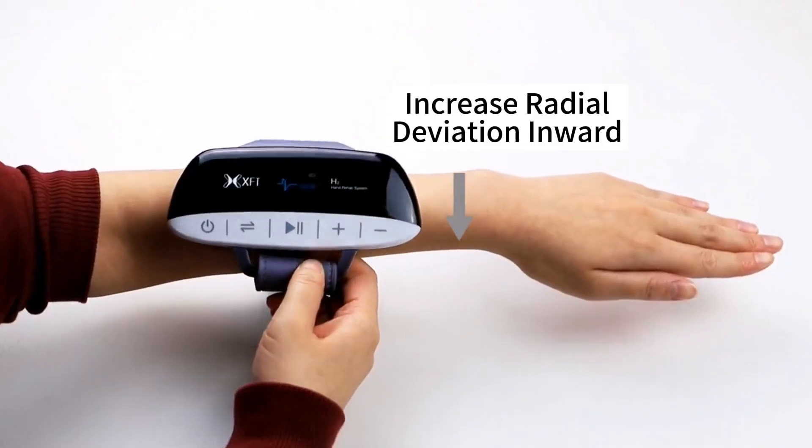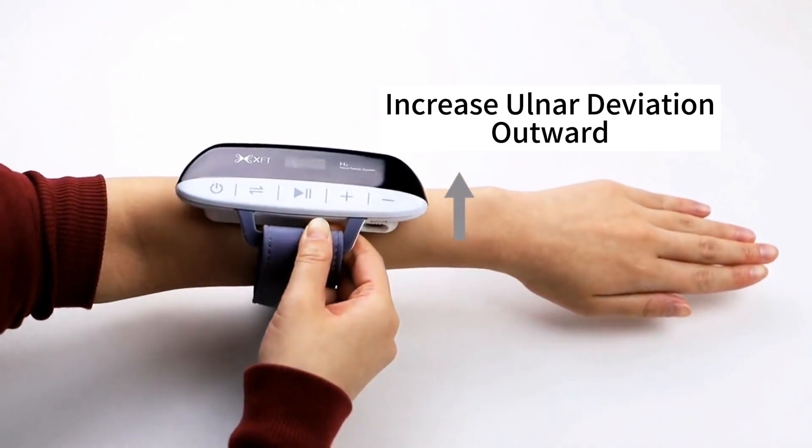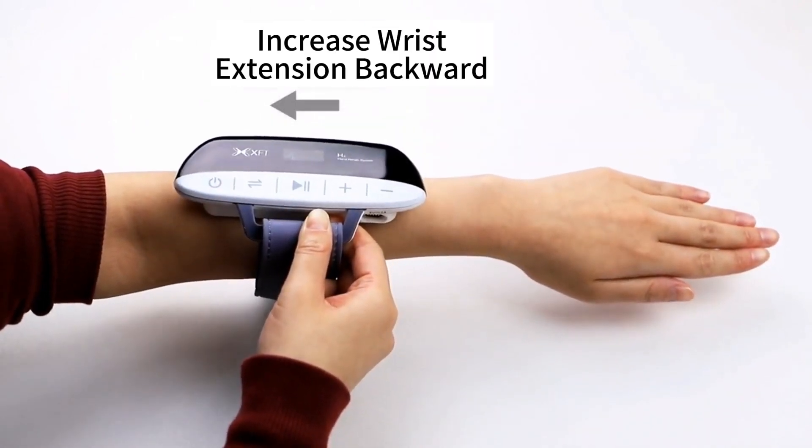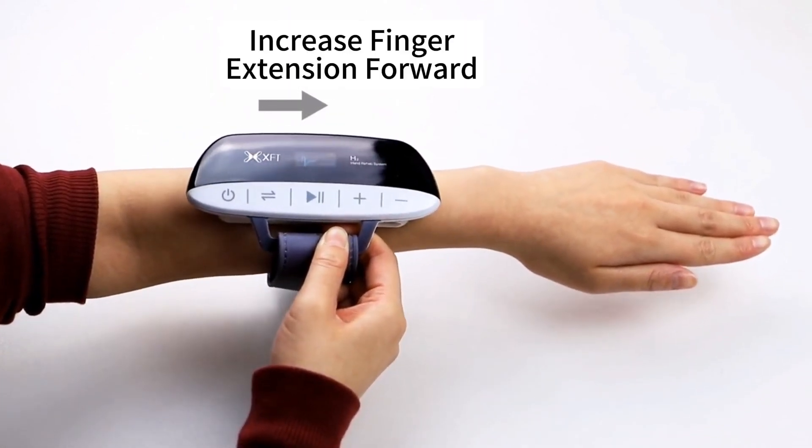Increase radial deviation inwards. Increase ulnar deviation outward. Increase wrist extension backward. Increase finger extension forward.